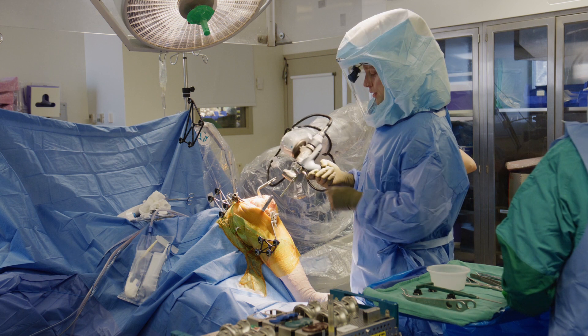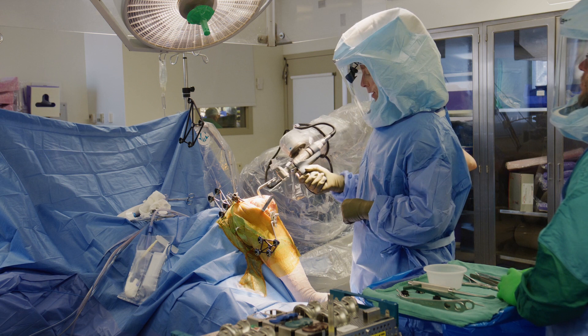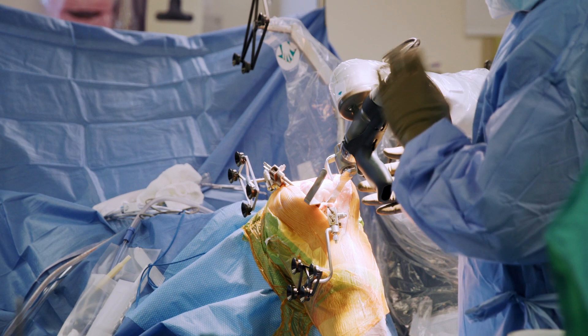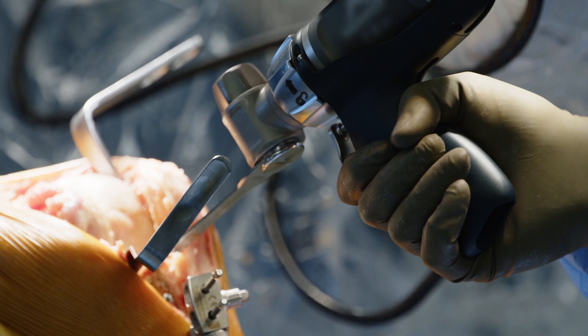Now you'll see when I bring the saw blade — this is how we're going to accomplish all of our surgery. We're going to change the shape of the bone to accept an implant. I get it close, and then the robot gets me on angle. Now I'm exactly at the right angle that I planned before, and I can't really move off angle. I can go straight, but I can't angle the robot — I can't move it up or down. It resists me and keeps me honest and keeps me in the right place.